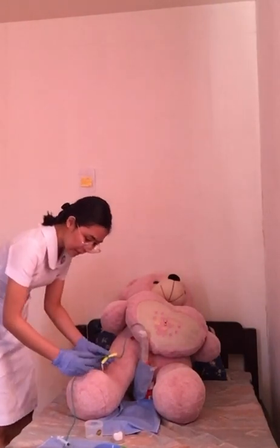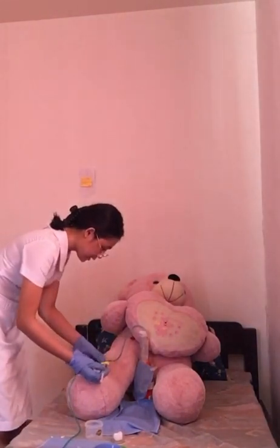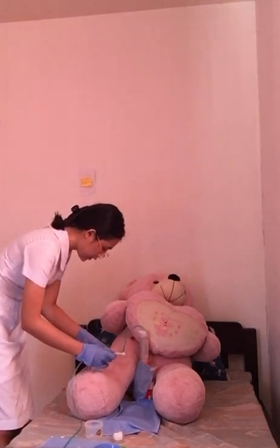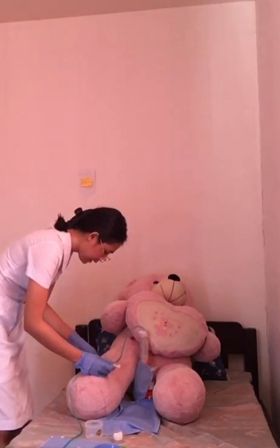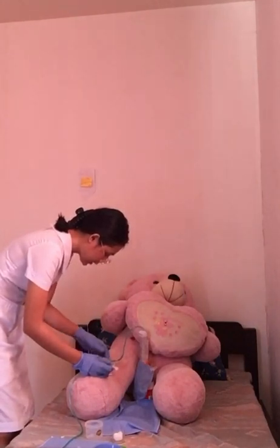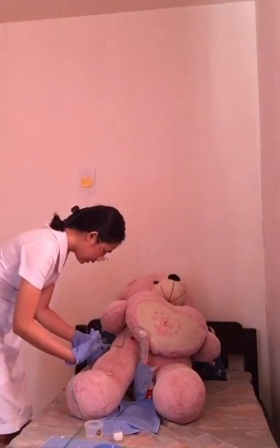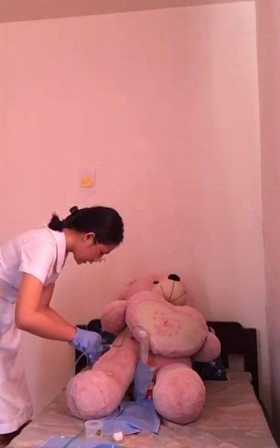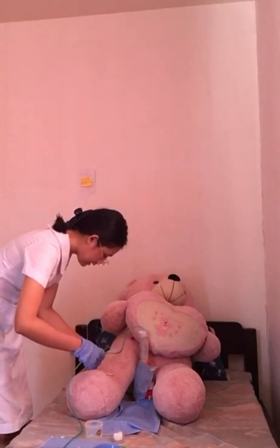After clamping our tube, we will be inserting our syringe, and then we will remove our tubing clamp and also the irrigating solution. We will instill our solution, and then we will aspirate it again. And then next, we will clamp again our tube.